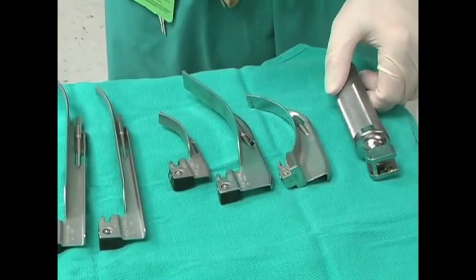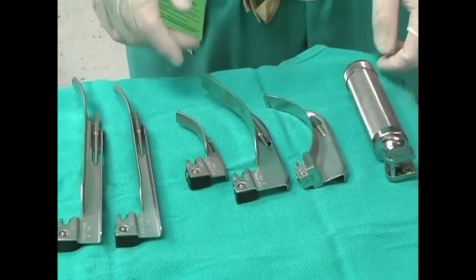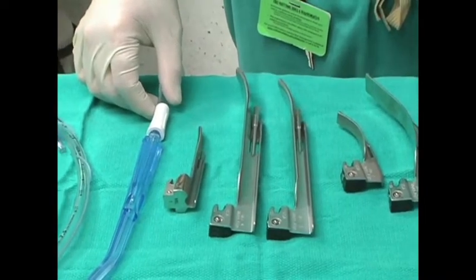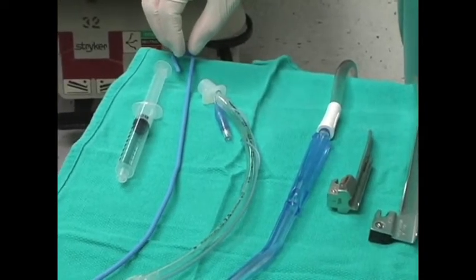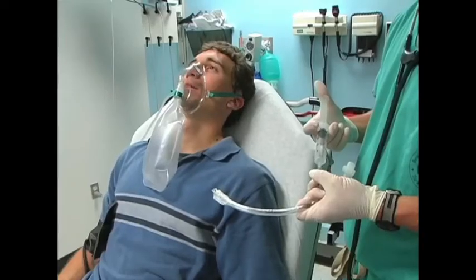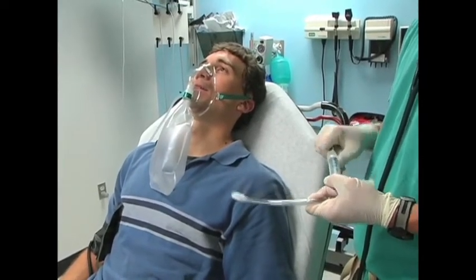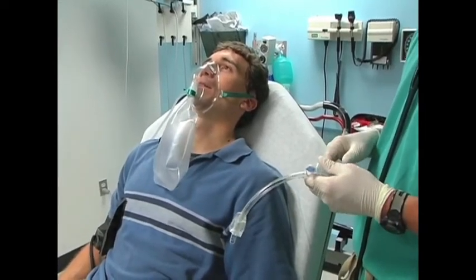Equipment for the actual intubation procedure is shown here, including a laryngoscope handle, several sizes of curved blades, several sizes of straight blades, the Yankauer suction, the endotracheal tube, a flexible wire stylet, and the syringe to inflate the cuff of the tube. Adequate ventilation and oxygenation must be ensured while the equipment is being prepared.